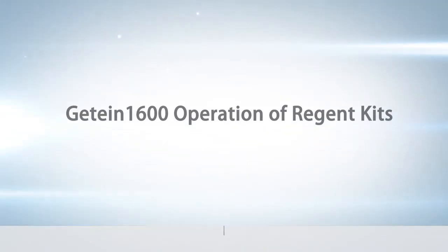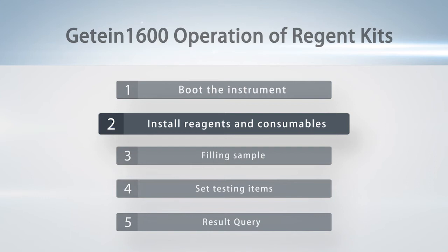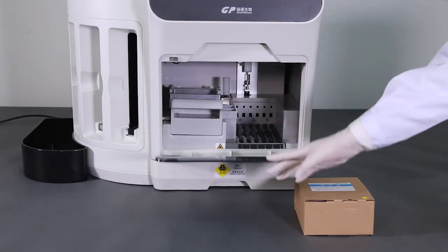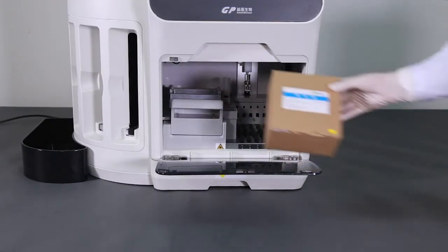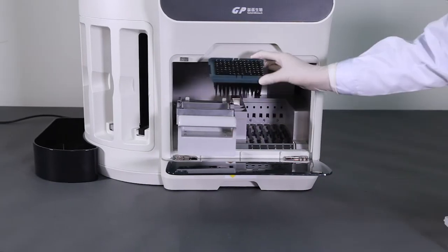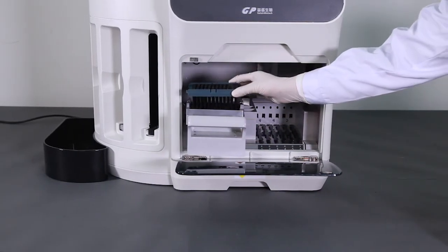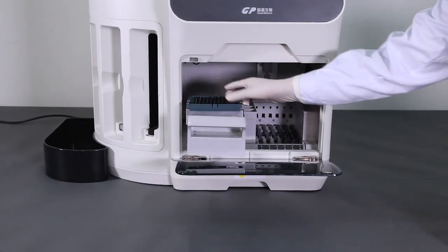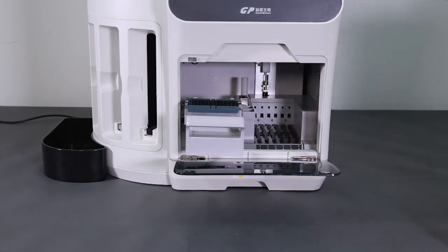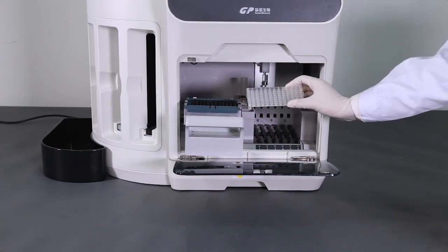Step 2: Install reagents and consumables. Place tip head, mixing plate, and diluent in the consumable location area. When inserting the tip, make sure the gap corresponds to cylinder.